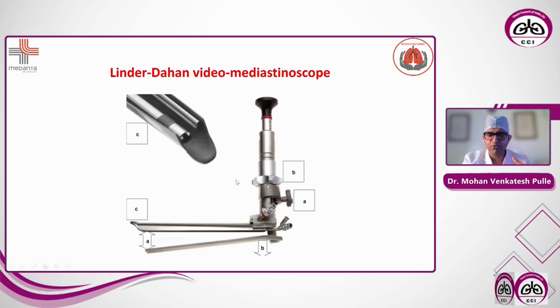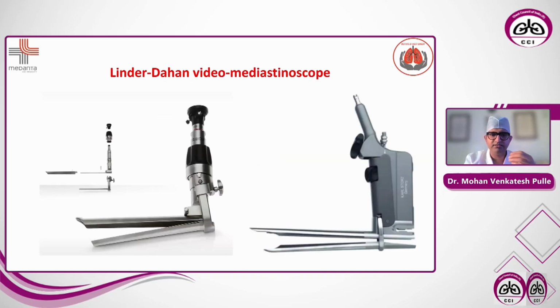Various companies have started inventing new technologies in the mediastinoscope, where a scope, a camera and a light source can be put within the scope, and the visualization and lighting can be improved. So this is the latest advancement that we have here, the Linder-Dahan video mediastinoscope, which is the latest video mediastinoscope that we have.